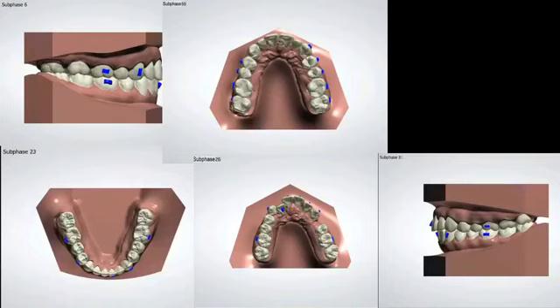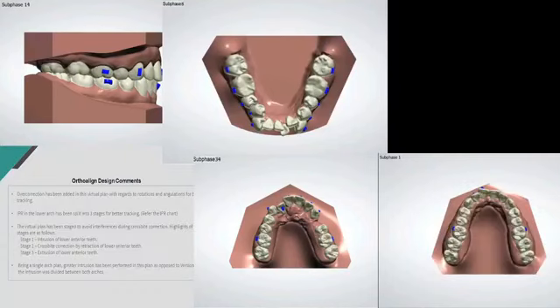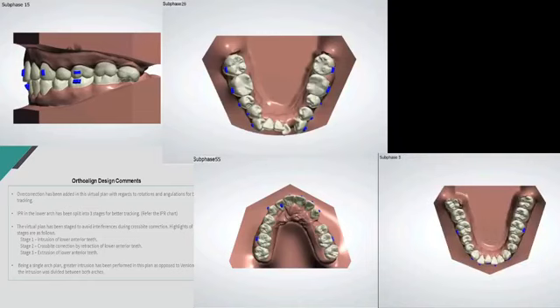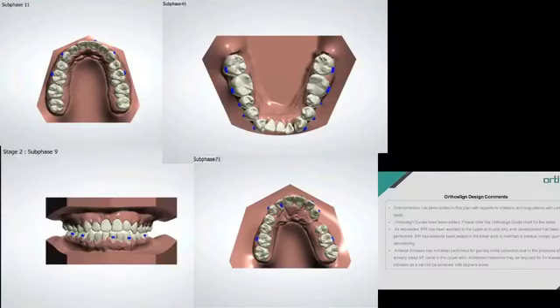Some attachments are placed on the palatal side or the lingual side of the teeth, and all of these attachments help to provide better retention and a better grip on the teeth, as the plastic tries to slowly move and manipulate the teeth and put the forces to pull the teeth to certain areas.